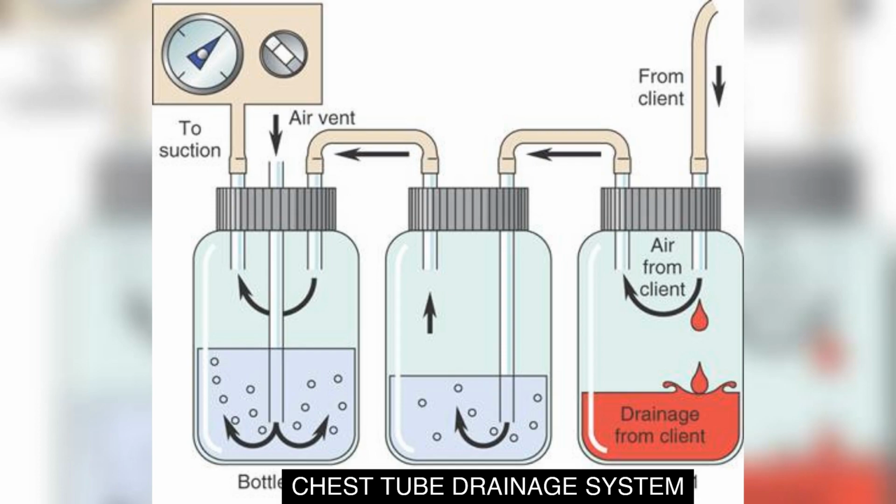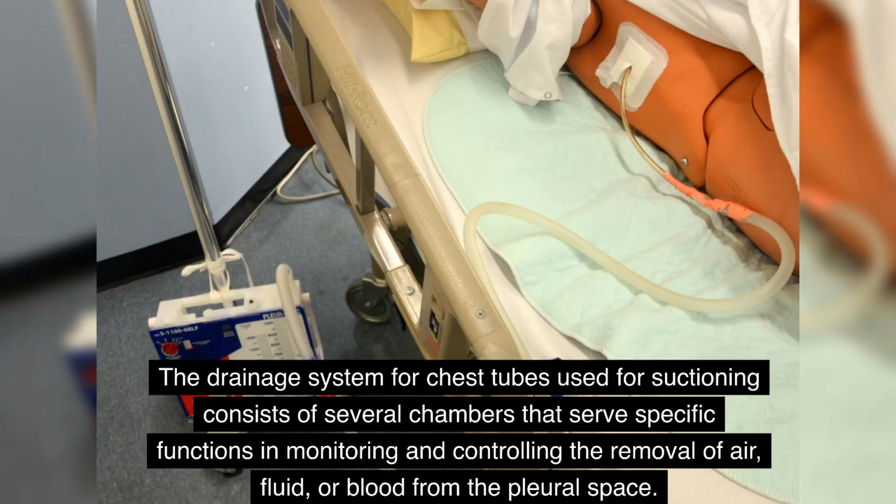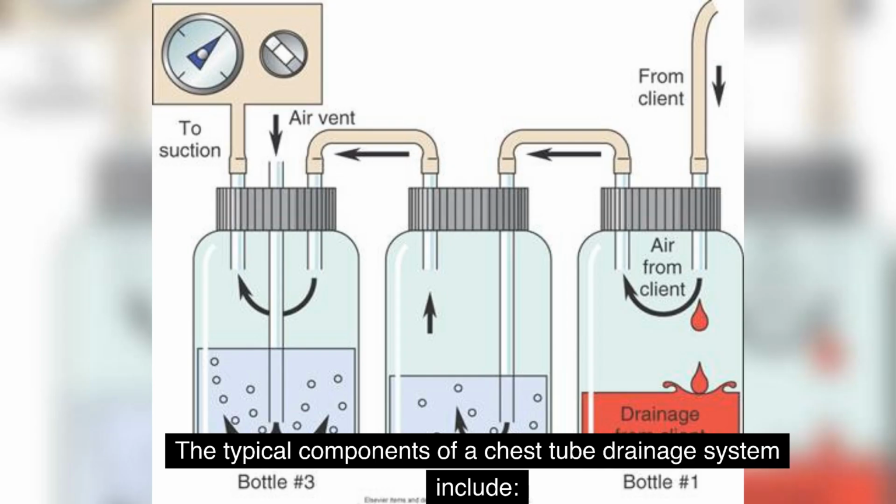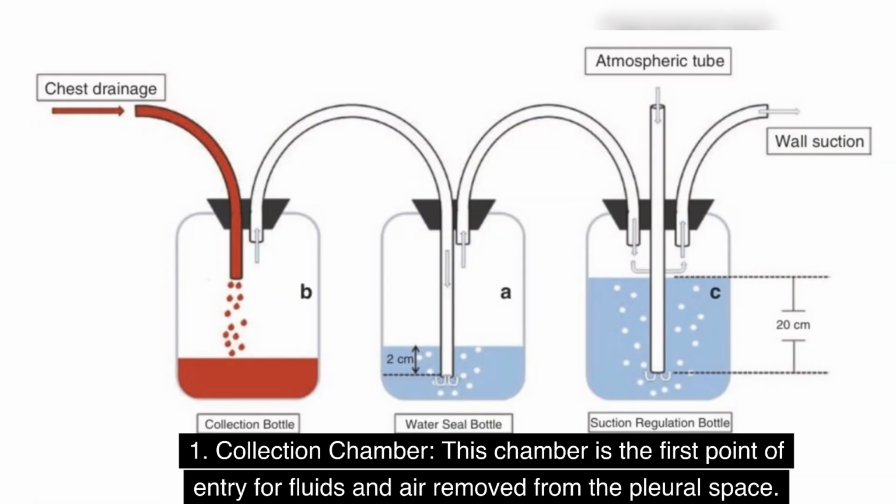Chest tube drainage system. The drainage system for chest tubes used for suctioning consists of several chambers that serve specific functions in monitoring and controlling the removal of air, fluid, or blood from the pleural space. These chambers are designed to facilitate the continuous assessment of the patient's condition and the effectiveness of the chest tube. The typical components of a chest tube drainage system include: 1.